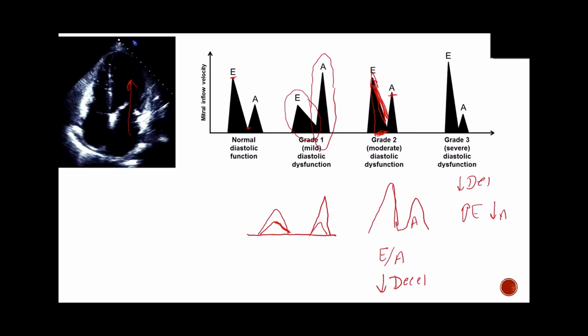Because you have increased intrathoracic pressure, your IVC is not going to fill all the way into your atrium, and your preload is going to go down. So what we see in that case is that people who have grade 3 diastolic dysfunction will convert to look like grade 2 diastolic dysfunction by that maneuver, because you're decreasing volume and therefore decreasing left atrial pressure, right? But in grade 4 diastolic dysfunction, it's fixed. So that person is not reversible with Valsalva maneuver.